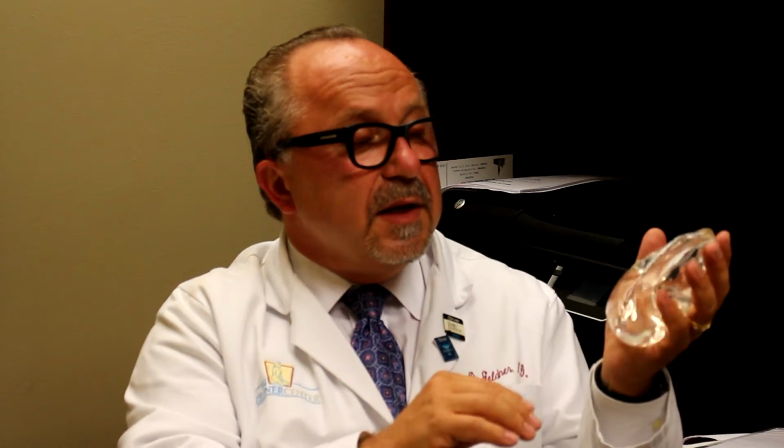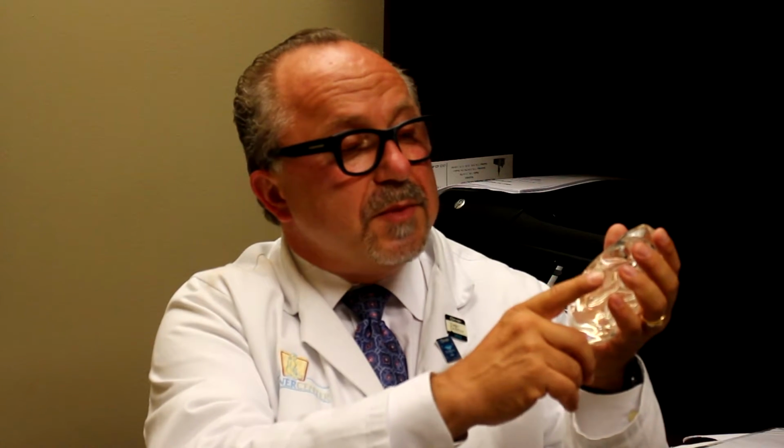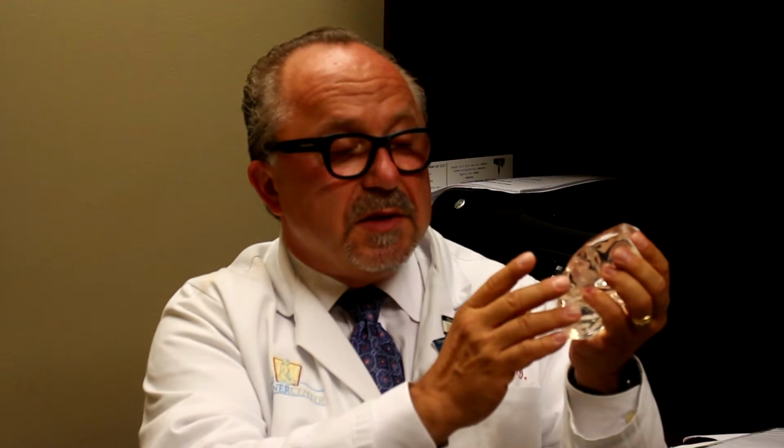The other thing is, if you take a look, the edges are smooth. And so in the patient who has an implant that you can feel and feels kind of funny, you've got little folds, this implant doesn't do that. Whereas this kind of an implant can have folds and irregularities, and some of these unusual little bumps that we can tell are simply the product of the implant sitting in a space.